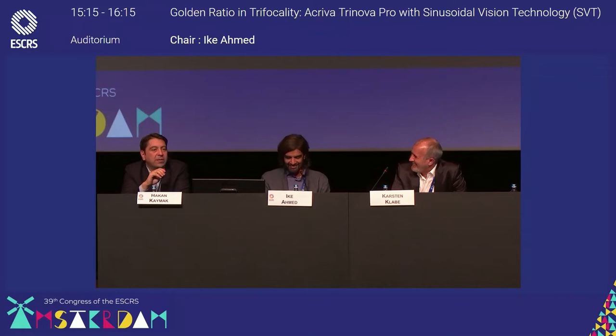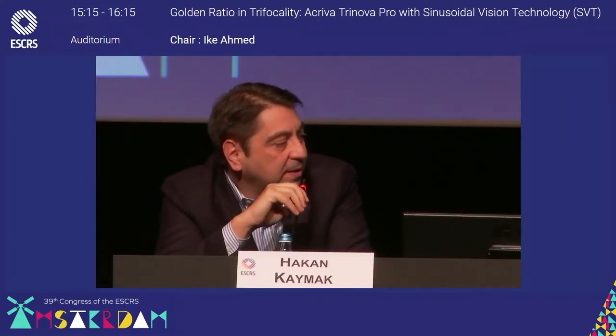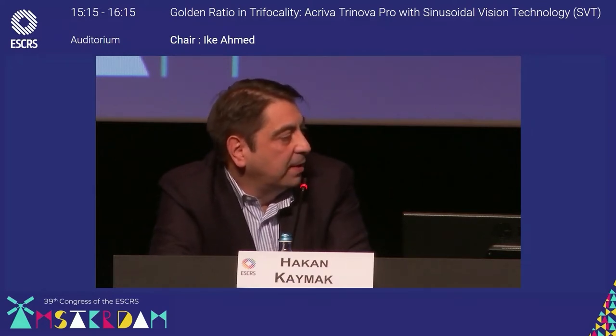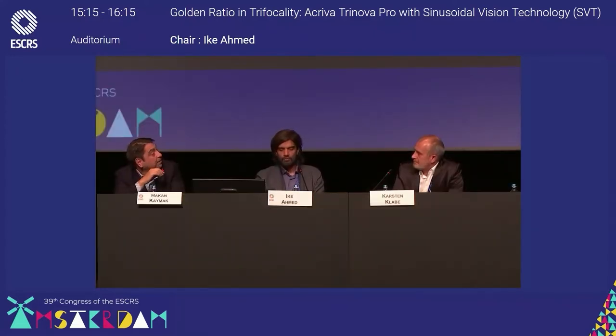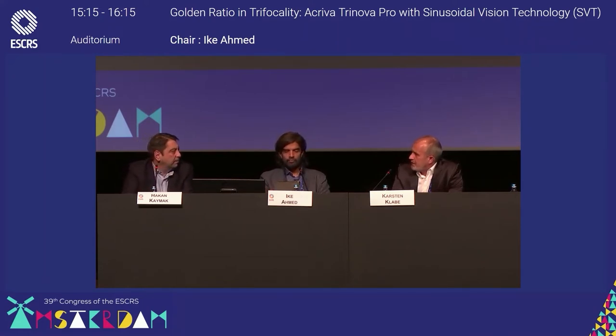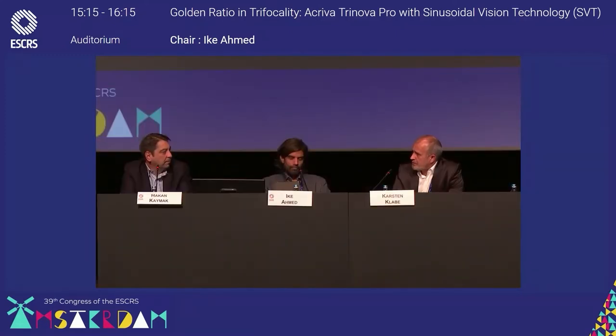Well, I think the first question is, when your patient really wants spectacle independence, then we have to use the trifocal IOLs. I think that's clear. It's not possible to have spectacle independence with other lenses, with EDOF lenses or something like that. It's really just possible with trifocal intraocular lenses. What do you think about this? So, in my opinion, you're absolutely right. We were talking over the last years about these blended vision concepts with EDOF lenses, but I was still a fan of trifocal lenses. So I'm sure that as soon as it's commercially available, I will adopt the Trinova Pro into my spectrum to treat patients, especially patients looking to be spectacle free.